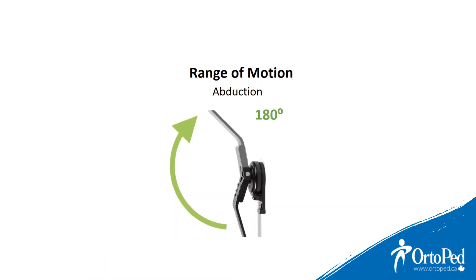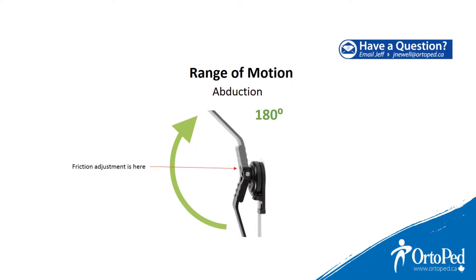The Axis Joint has 180 degrees range of motion in abduction. The abduction friction of the Axis can be adjusted very easily with a four millimeter Allen key situated at the top of the shoulder joint.